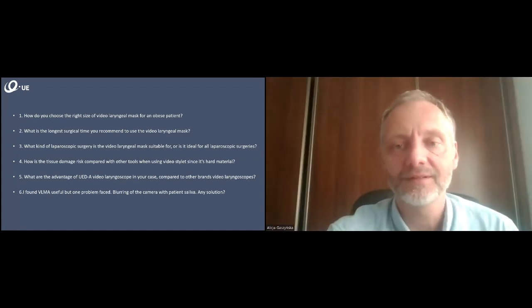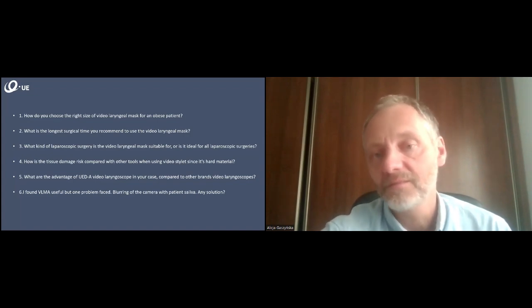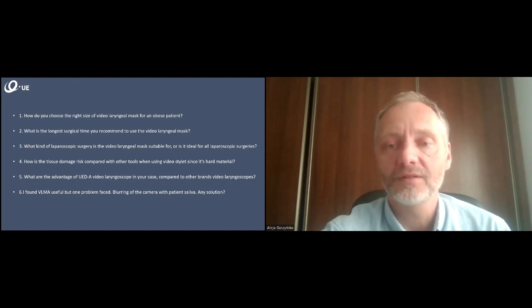Thank you very much, Max. And as in my practice, I deal a lot with obese patients. I absolutely agree with you that the body weight is not, in fact, an indicator, but rather the height and body composition and the composition of the neck. This is very important to choose the right size. And in fact, what is quite surprising, maybe for other anesthesiologists, laryngeal masks, supraglottic devices generally work very good in obese patients, but we should know that this is for temporary ventilation, for short procedures.